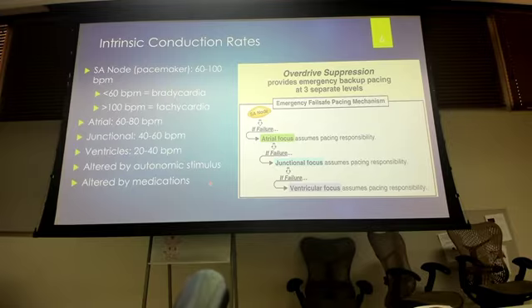Now, occasionally that heart rate is going to be less than 60, and if it is less than 60, it could totally be normal. Most of you have heart rates less than 60 because you're otherwise healthy, you run a lot, and all those things make for a healthy heart. But anytime a heart rate is less than 60, even though it can be a normal parameter, we consider that a bradycardic rate. So bradycardia means a heart rate less than 60.